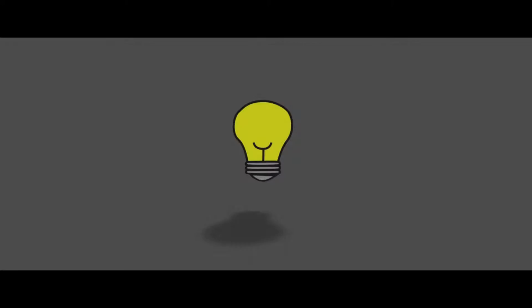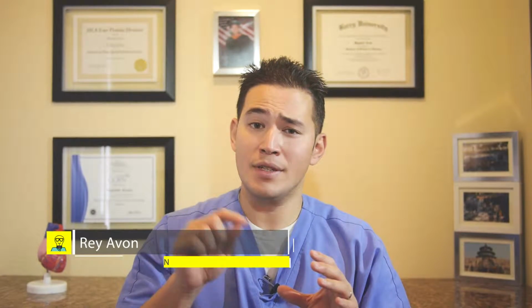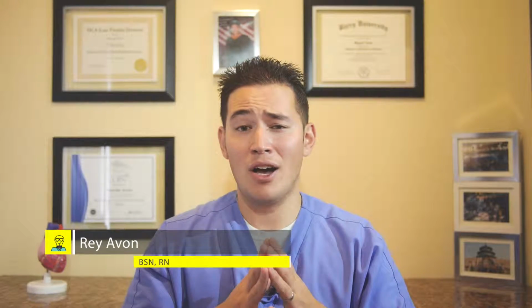Today we are going to talk about the procedure called cardiac catheterization, or cardiac cath, and everything you need to know to help you be prepared. A cardiac catheterization is a medical procedure. It's used to look inside your heart and see if you have any heart problems. This procedure is performed in the hospital by a cardiologist with special training.